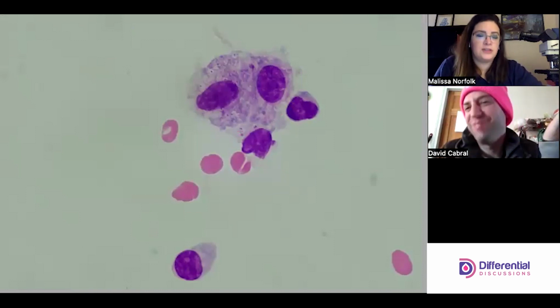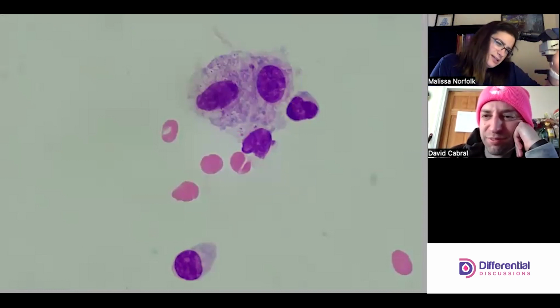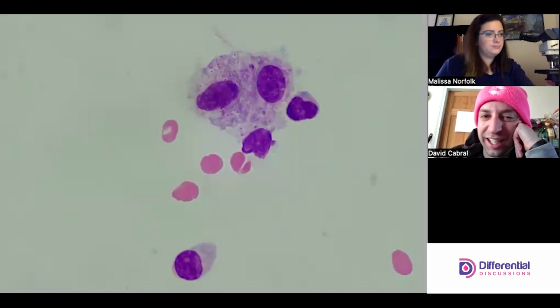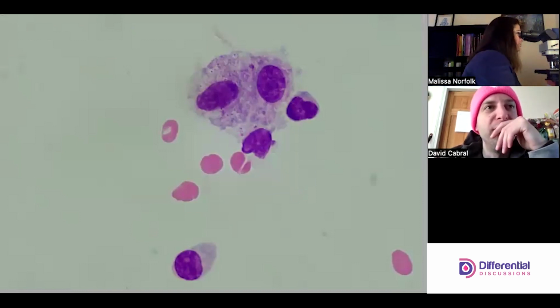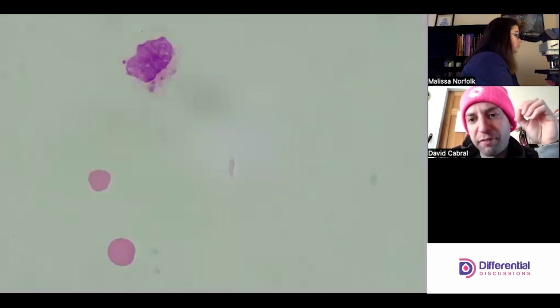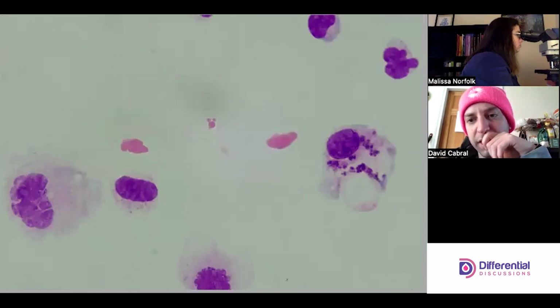If you're leaning towards malignant versus normal, then that has to be further explored. But if you're leaning towards normal categories, that's different. So far, my intuition is that this is likely a reactive picture, but there's a reasonable amount of evidence for us to kick this up the chain. So don't ever feel bad doing that.